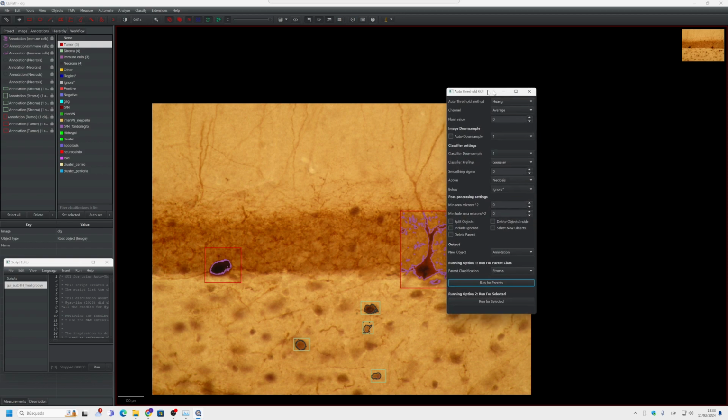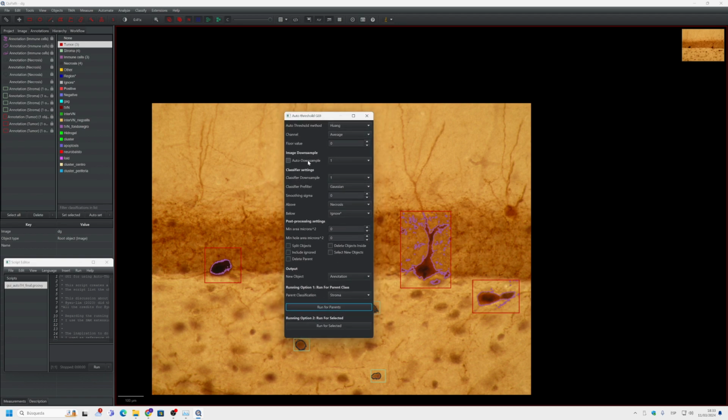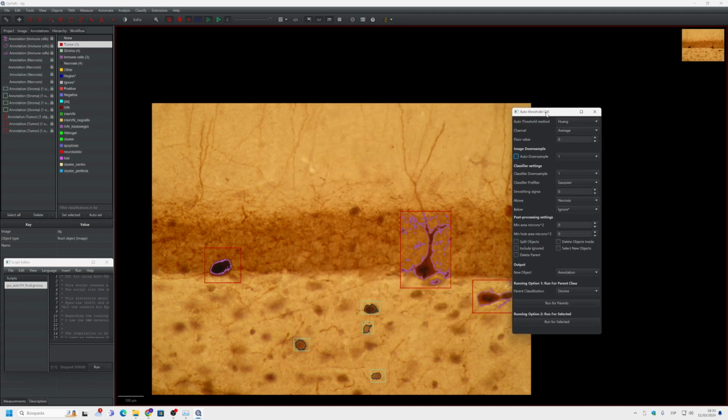I think that it's a really nice feature that perhaps could be in QuPath in the future with the auto downsample, for example. And I've done this as an alternative for the Segment Anything extension. At least I'm using it in this way in the lab. This is because, for example, in this computer that I am using right now, we have a super powerful CPU, but we don't have a proper GPU. And although with Segment Anything everything is really nice, if I put a lot of annotation objects, sometimes it's quite slow and it gets stuck.